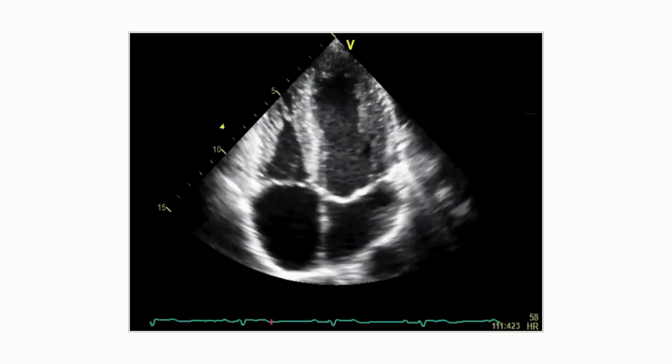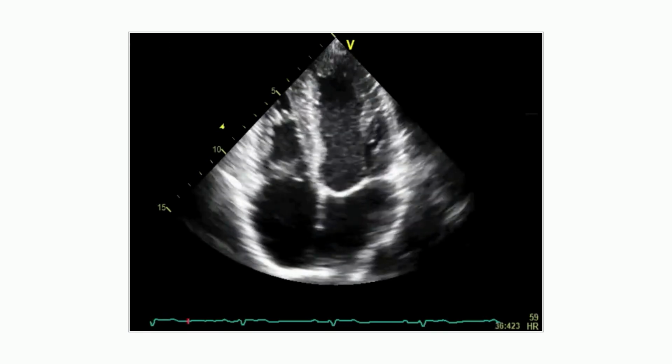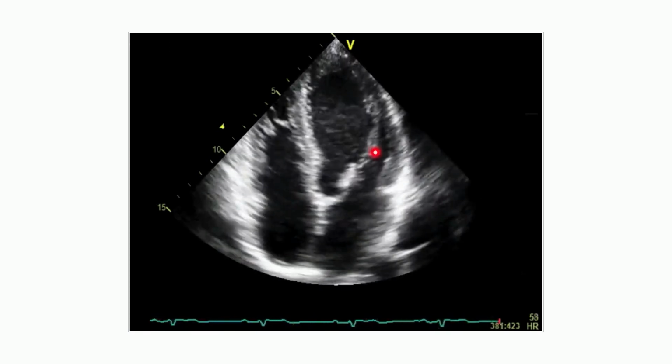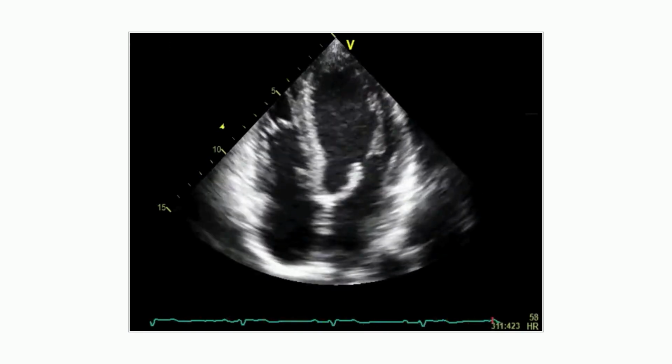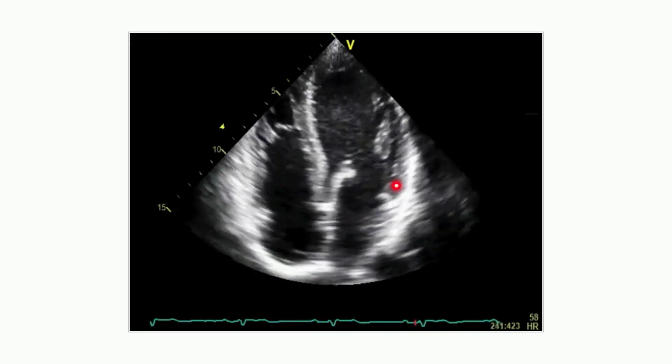If we assess left ventricle function, we'll be looking at several things. Importantly, we'll be looking at the so-called inward motion of the endocardium. You see that all the different segments are moving to a center. On top, we also see that the level of the mitral valve is moving towards the apex. That's exactly what we'll look at when we assess left ventricle function.